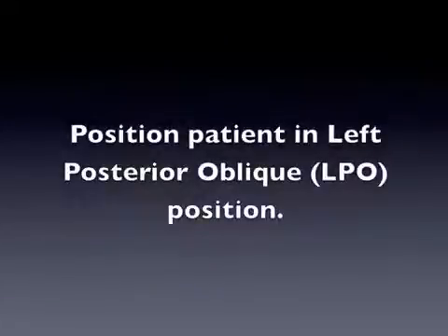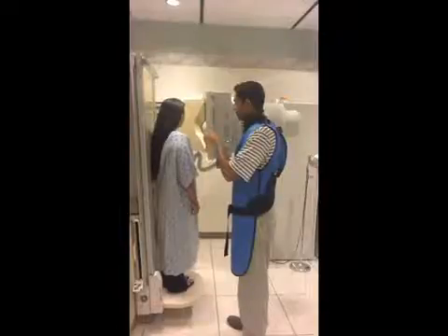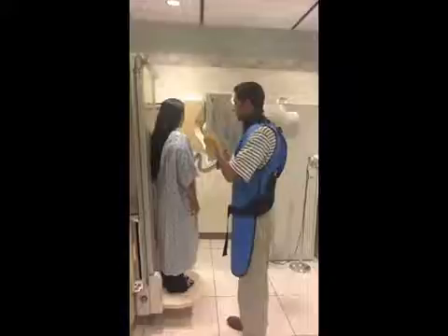Position the patient in the left posterior oblique, LPO, position. This means that the posterior portion of the patient's left shoulder will be touching the table and the patient will be at an oblique angle towards the camera.